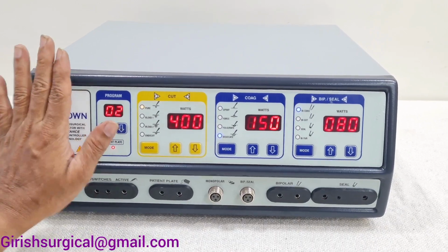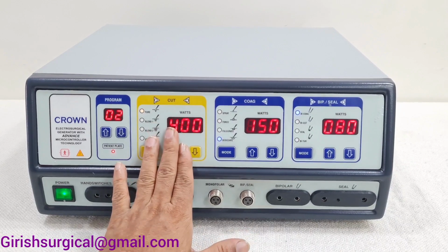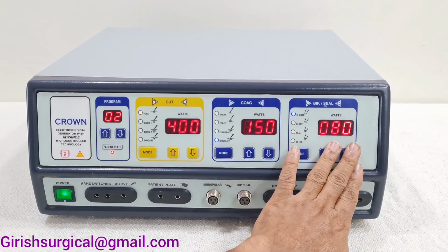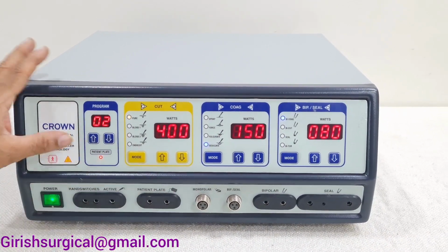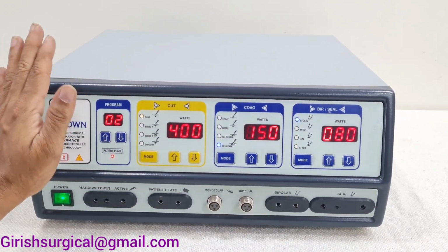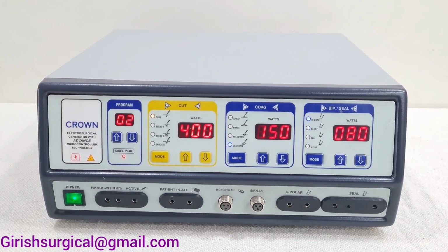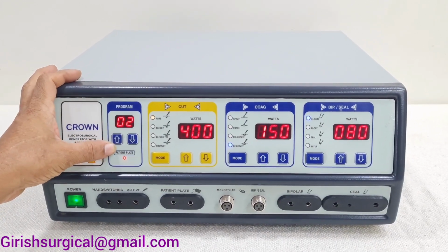Now he does the surgery and goes, and a second doctor comes to do laparoscopy surgery and selects program number 2. On program number 2 he has selected 400 watts for the cut, 150 for the coagulation and 80 for the bipolar sealer. And likewise up to 99, doctors come and do surgeries. Then, after a year, they come back and are willing to do the same surgery with the same output.